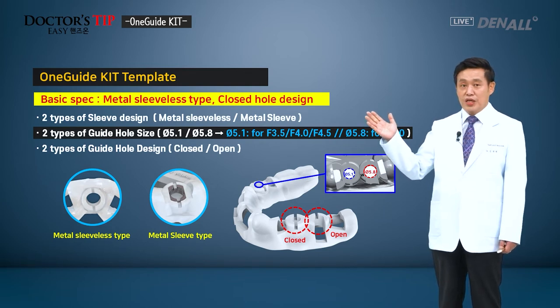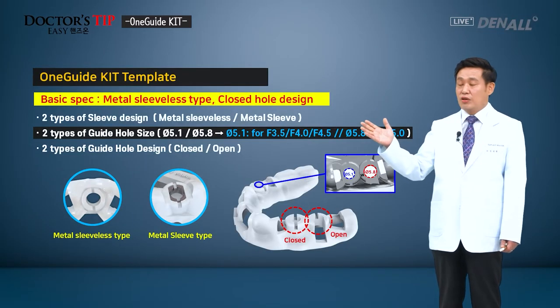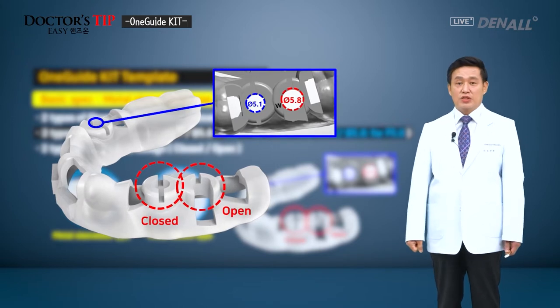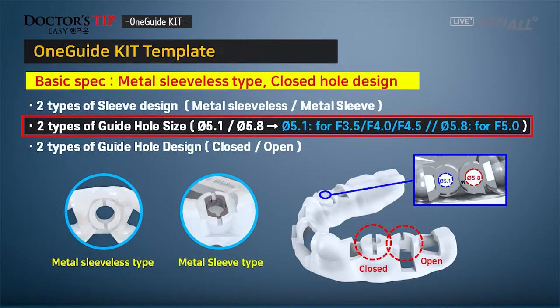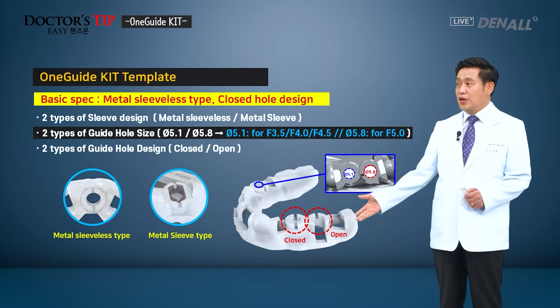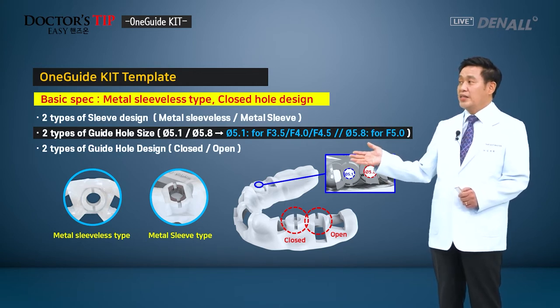Characteristics of the OneGuide KIT template. As mentioned, the basic spec is that it does not have a metal sleeve, and the whole design is a closed system. However, as was in the past, if you want a metal sleeve, you can make it so that it does have a metal sleeve. The guide hole size basically is 5.1 and 5.8 in diameter. For the 5.1 diameter, the fixture size is 3.5, 4, and 4.5 in diameter. So if you want to place a 5.0 diameter fixture, you can use the 5.8 diameter wide hole design. So you can use the two different holes on the same template, so you don't need to change the template and can use one template to place a smaller implant and 5.0 diameter wider implants.